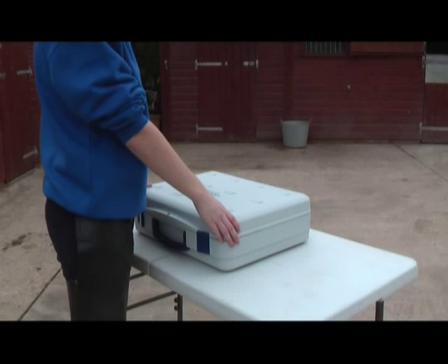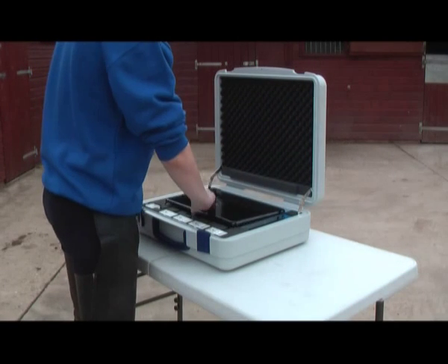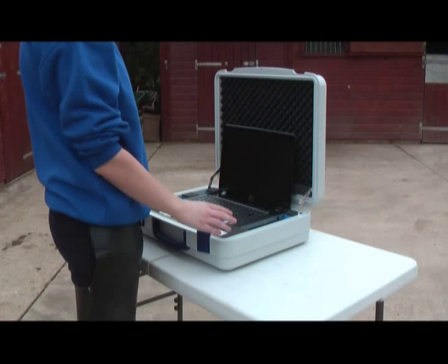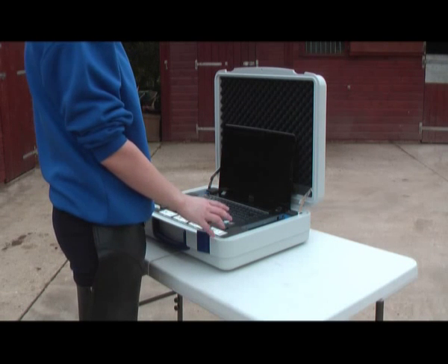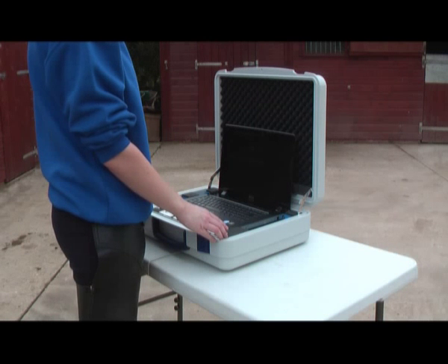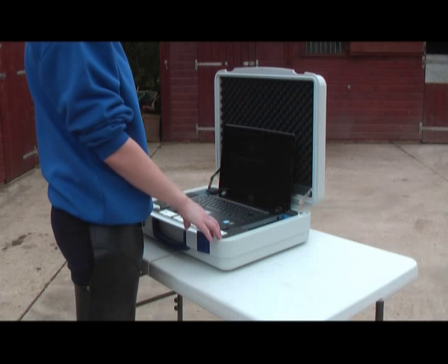Now we're going to set up the system to get our horse profiled. I need to switch on the laptop and then set up the sensors, which will involve getting the GPS signal and then timestamping that to the other four limb sensors.